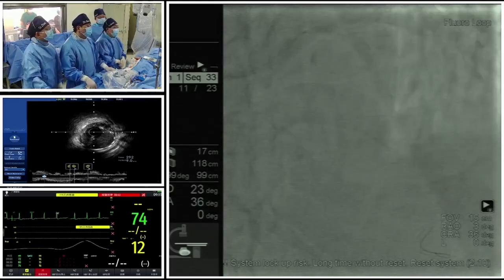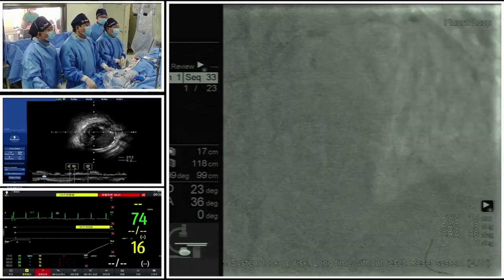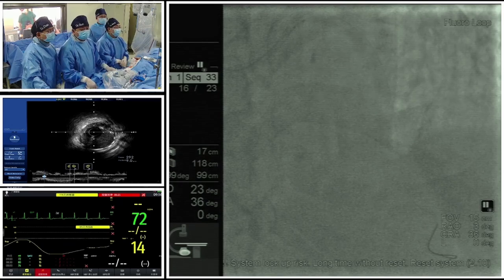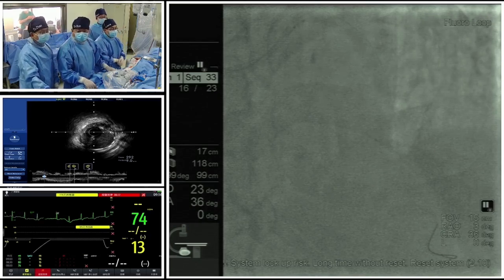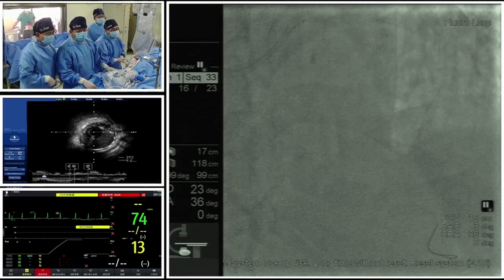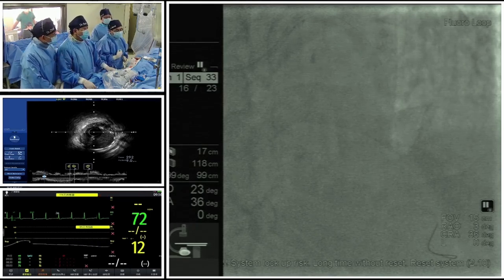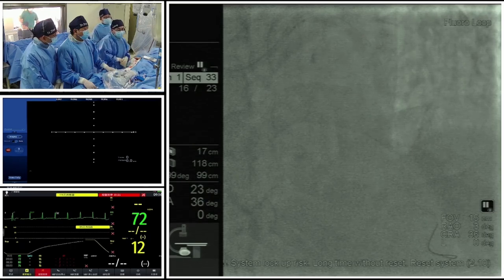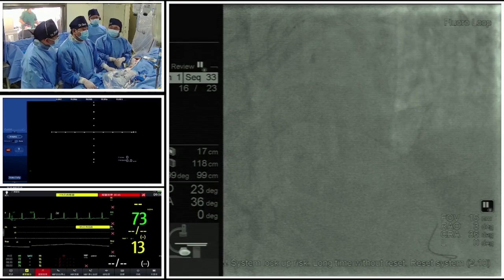So the LAD lesion should be treated with PCI because of its significant hemodynamic effect. Next, we will perform intravascular imaging to guide our detailed procedure. Of course, for this patient there are multiple coronary fistulas, and the hemodynamic effect of a coronary artery fistula differs. We will talk about this detailed information with Dr. Zhao.